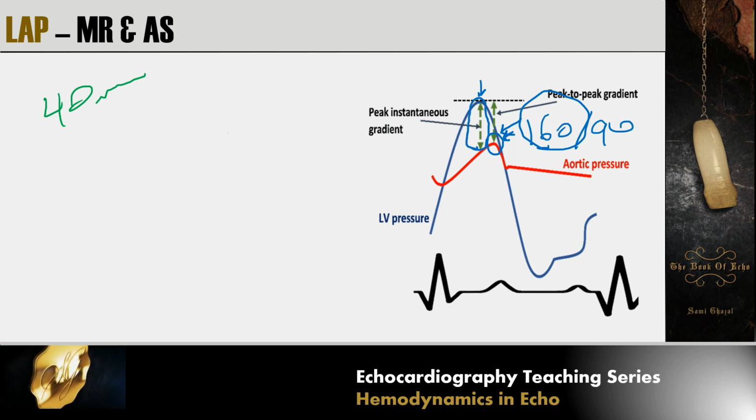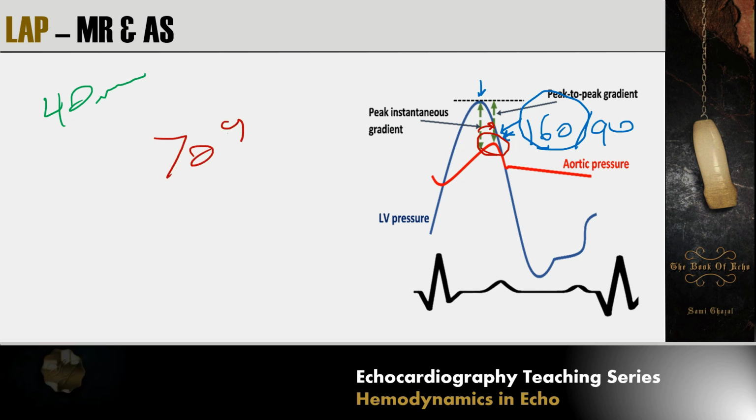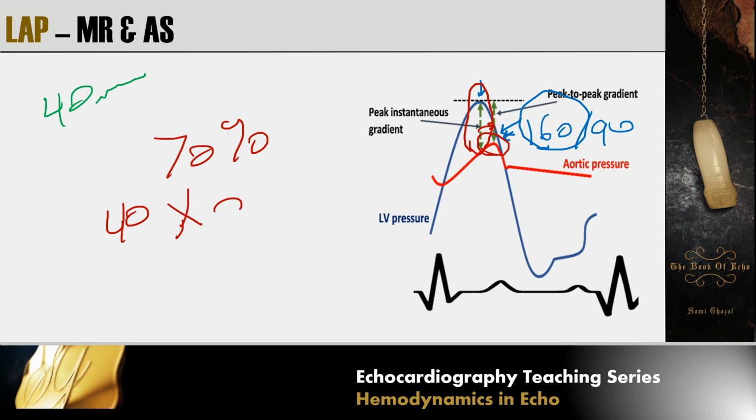We measure it here. So what we need to do is correct this gradient to shift it rightward to coincide with the peak of this systolic blood pressure. How to do that? The usual correction factor is around 70%. So we have this peak instantaneous gradient. Let's say the gradient is 40. Now we have to multiply it by 0.7.